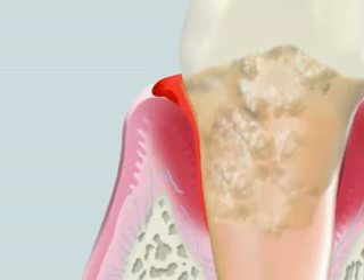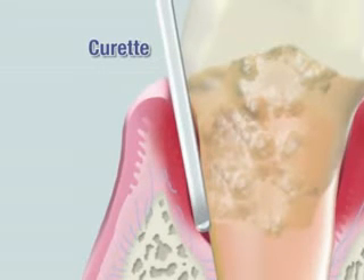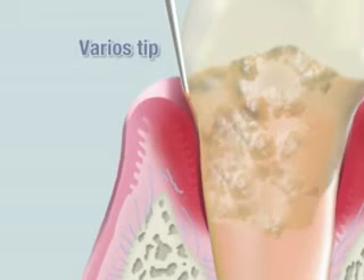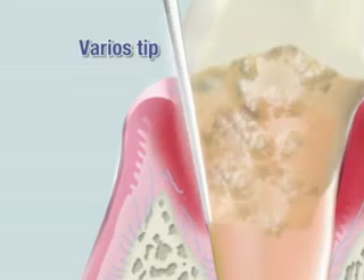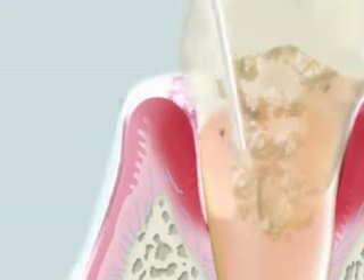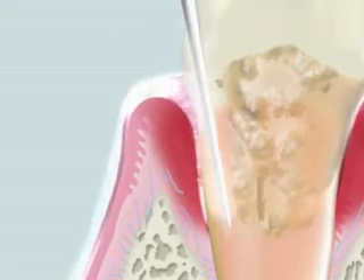An ultrasonic scaler is used to remove them. Since periodontal pockets are deep in a severe periodontitis case, thinner tips are used to reach the bottom of the pocket. Very fine tips are available for Varia 750, allowing cleaning of the area that is difficult to access with a curette.